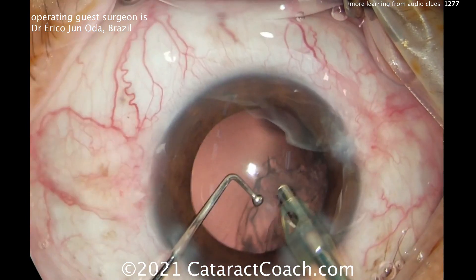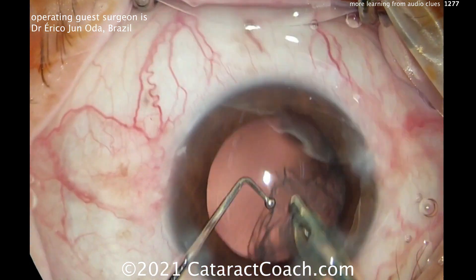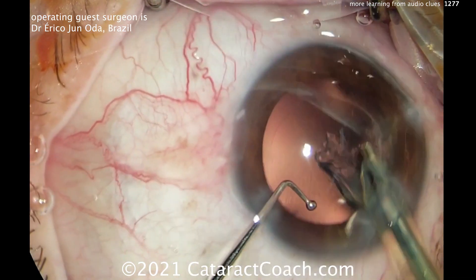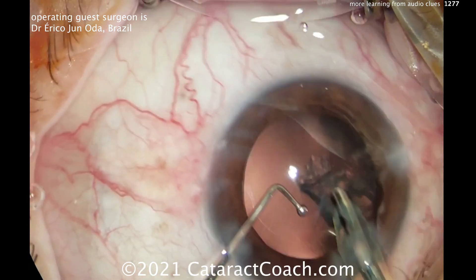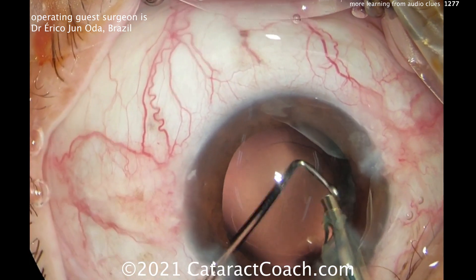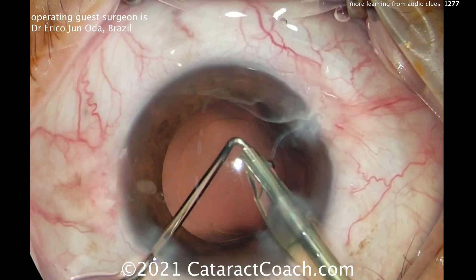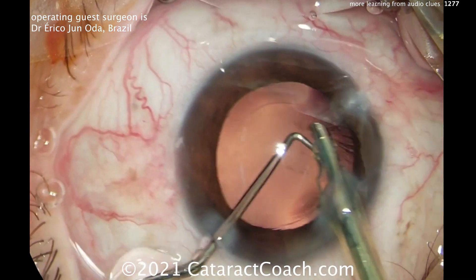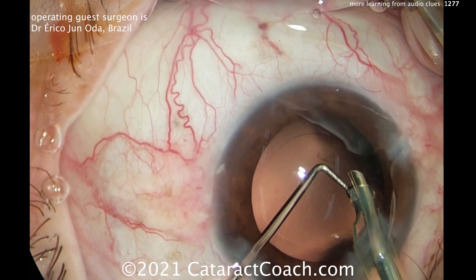Stay in position 2 and give a little bit of 2. When you have that high vacuum sound and the pieces on your tip, a little bit of position 3 for the energy. Look how he's titrating his foot right now — just using the FACO probe to remove cortex. If you've got good control, you can easily do that. It's cleaned up pretty nicely.